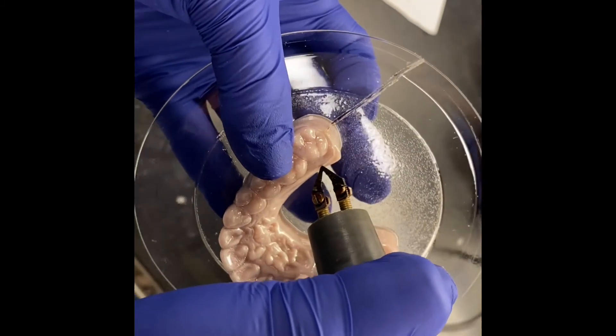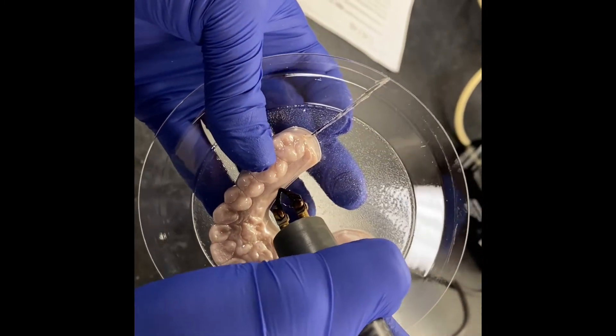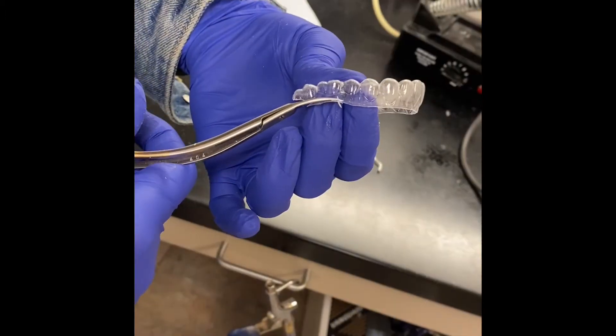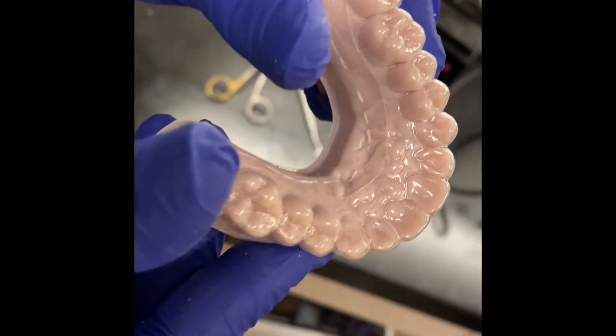Using our hot knife, we will remove the excess material from the model, and finally trim the retainer for a perfect fit.